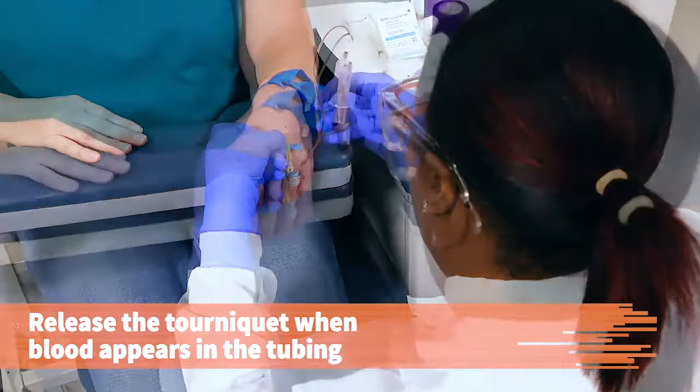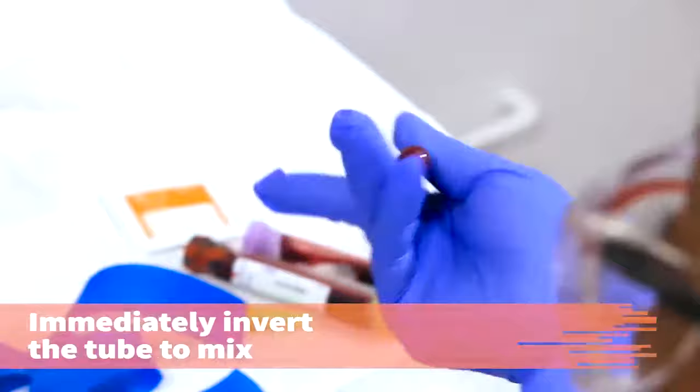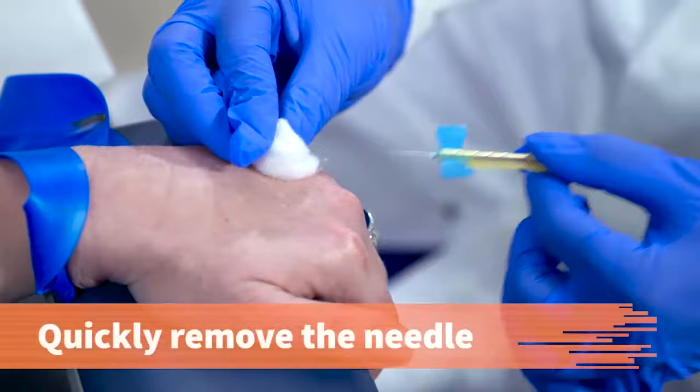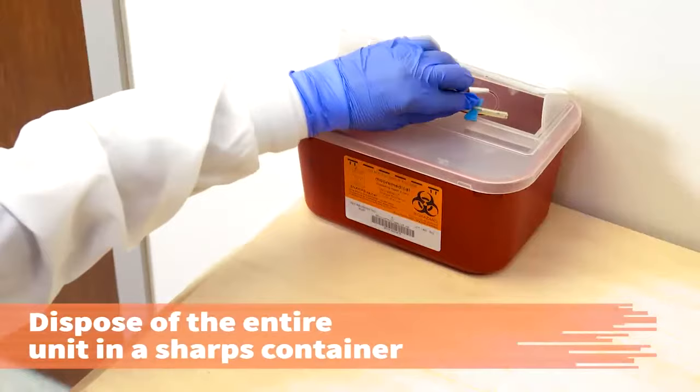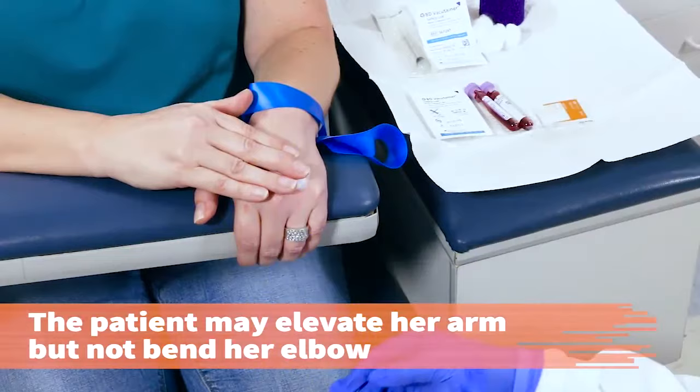Release the tourniquet when the blood appears in the tubing. Always keep the tube and the holder in a downward position so that the tube fills from the bottom up. Immediately after removing the tube from the needle holder, gently invert the tube to mix the additives and the blood. Place a gauze pad or cotton ball over the puncture site and gently remove the needle, engaging the safety device. Dispose of the entire unit in the sharps container. Apply pressure to the gauze or instruct the patient to do so. The patient may elevate the arm but should not bend the elbow.